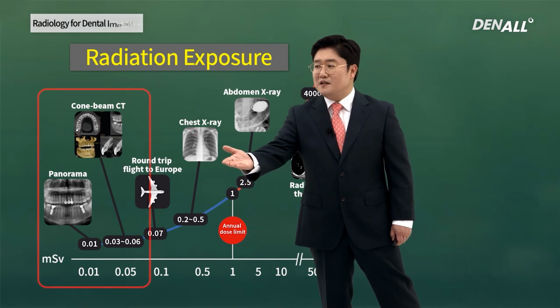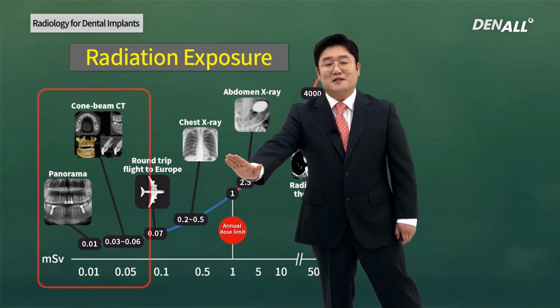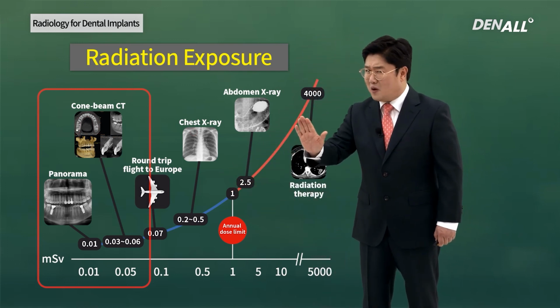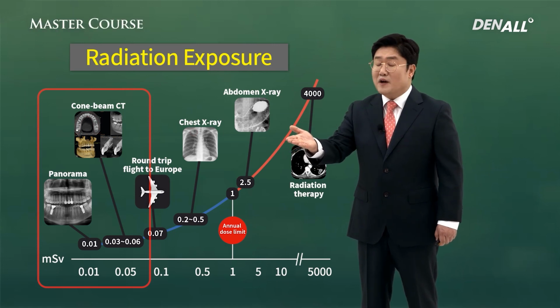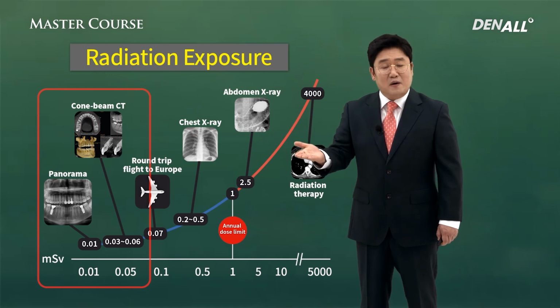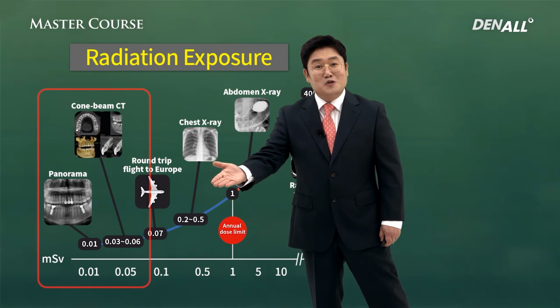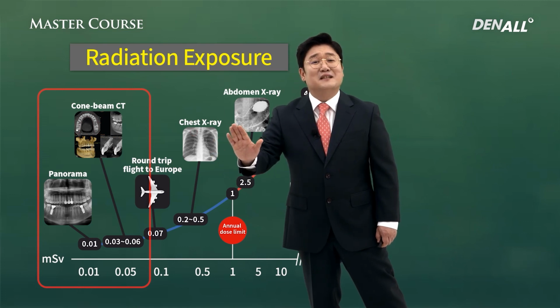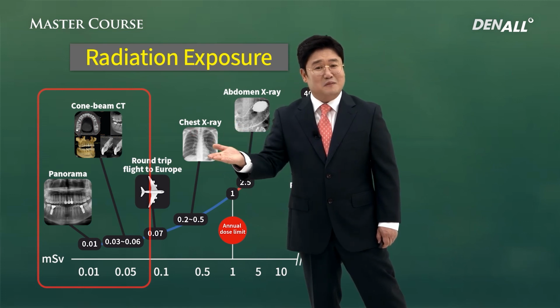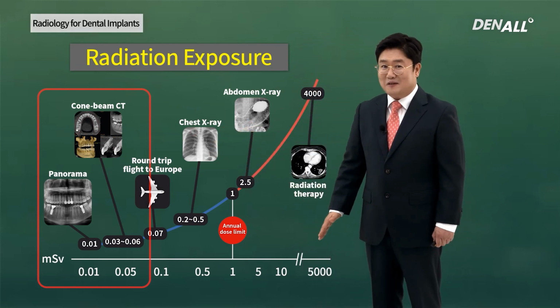Panorama, CT has very low level of exposure. Standard periapical would be much lower than this, so it doesn't appear even on this diagram. When you explain this to your patients, maybe you can say this. Round trip flight to Europe has more radiation exposure than dental X-rays. That means dental X-rays are very safe procedures.